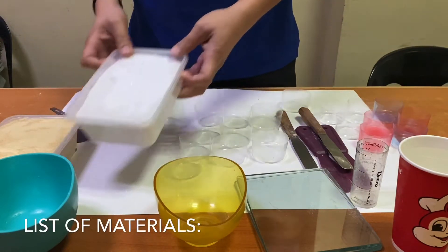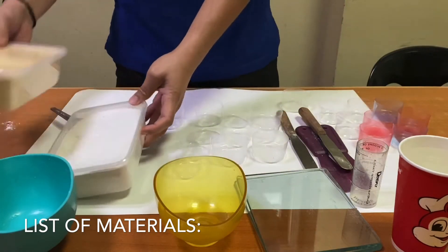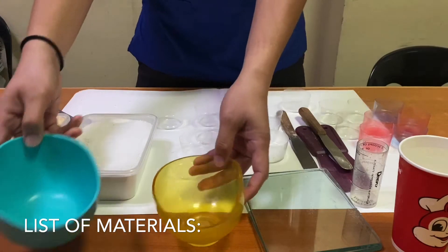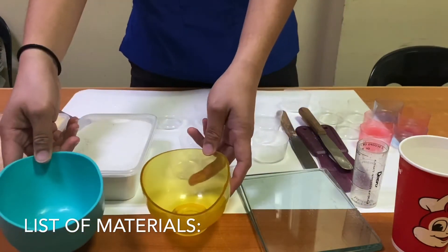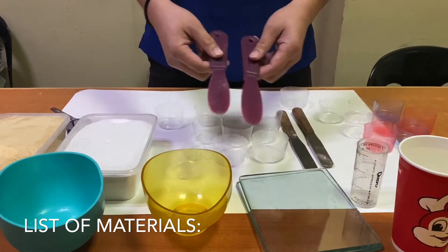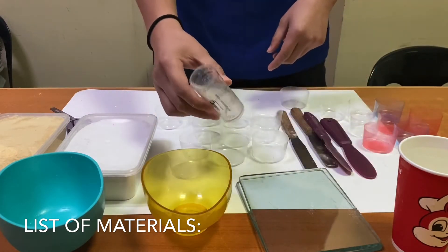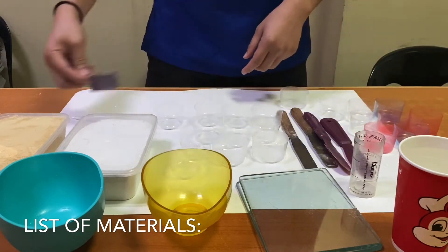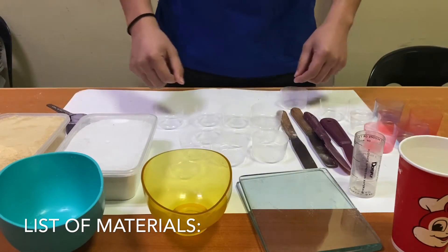Plaster of paris, one pack; dental stone, one pack; rubber bowl, two pieces; plastic spatula, two pieces; water measuring canister, one piece; powder scoop, one piece; cups, 20 pieces.